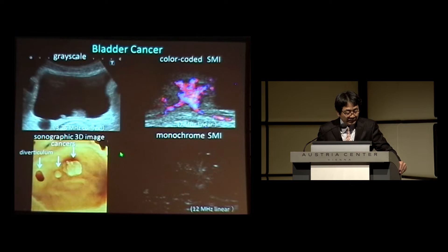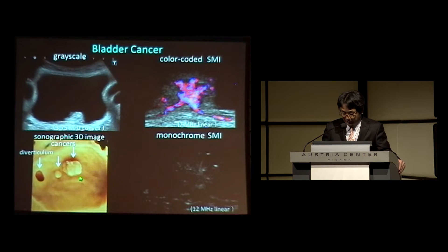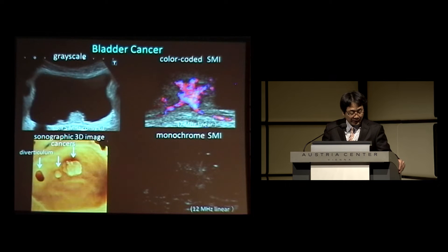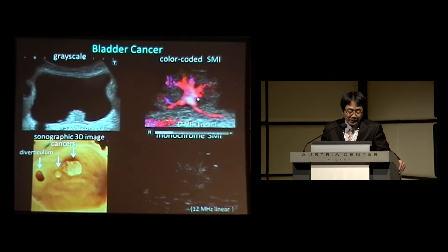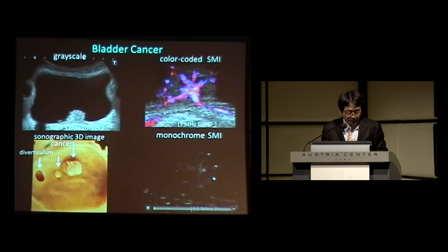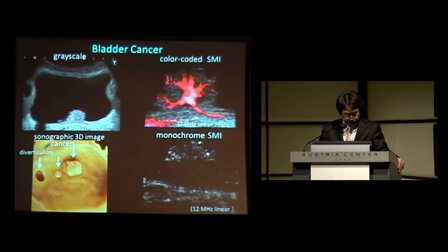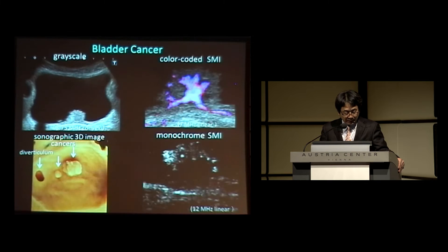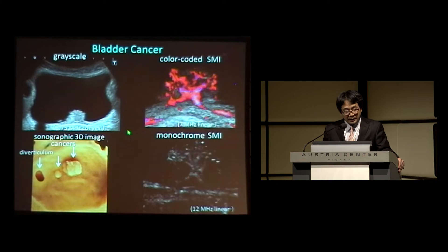This is a case of bladder cancer. There are a couple of tumors and also a diverticulum. This 3D ultrasound image helps you understand the shape of these lesions. On color-coded SMI, you can see a branch-like structure of this tiny tumor. And monochrome SMI, which is more sensitive to lower blood flow, shows very fine vascular structures that confirm the diagnosis of bladder cancer.